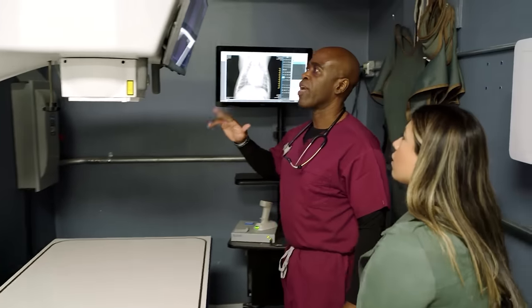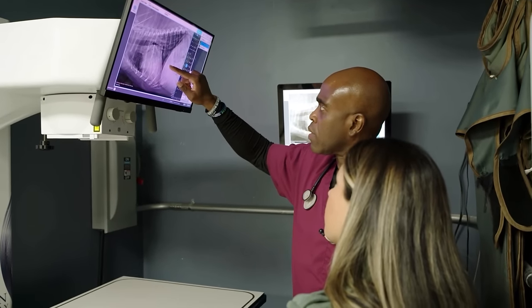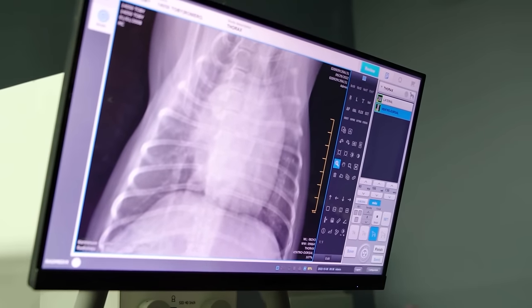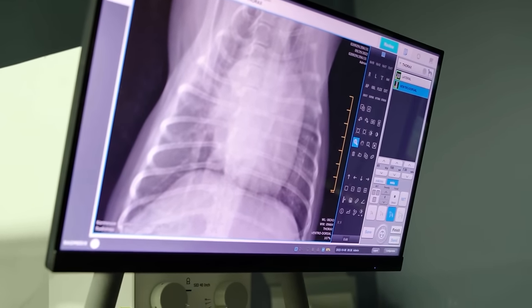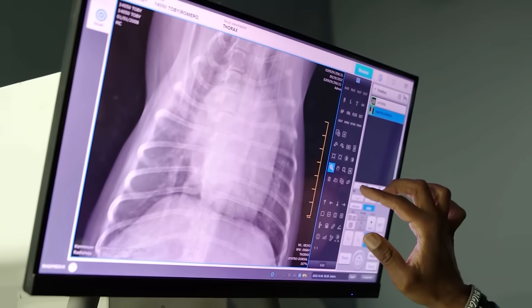All right, so I'm gonna show you his radiographs. Toby desperately needs surgery on his diseased teeth, but a long-standing heart condition has so far prevented that. You can see how big his heart is. He has a moderate left atrial enlargement, but he also has severe enlargement of the left ventricle. All right. His heart is not in a good place.